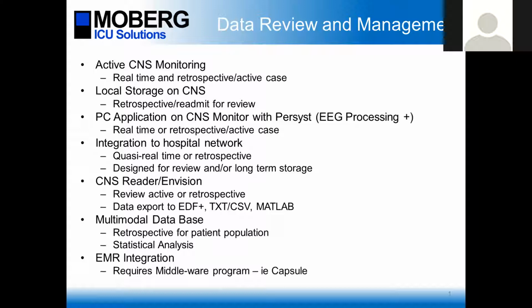So it's designed for review, and it's also a way for these patient cases to go into a long-term storage file. Folks who are given permission to access those files can go back and look at those cases at any time. So integration into the hospital network is a really valuable thing. If your hospital is going to do that, we try to encourage them to have that IT infrastructure put into place before we do training, because we want to make sure that everything is up and running at the time that we come to do training, so that we can actually assure that the system is working the way it should.